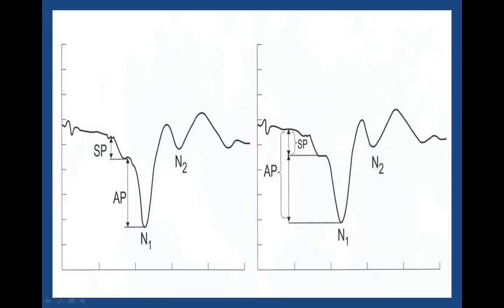When you say compound action potential, that implies a more limited segment of the basilar membrane is excited, and generally when we record compound action potentials, a tonal stimulus is used, whereas a click evoked response is generally referred to as whole nerve. Both are misnomers because even the compound action potential excites sidebands to the center frequency and gives you a response that's broader in spectrum than one might think by the labeling.